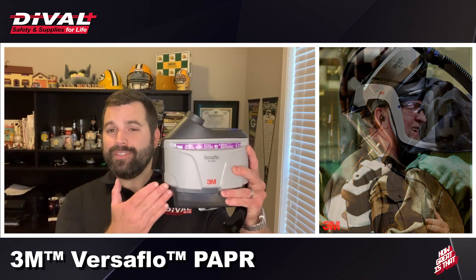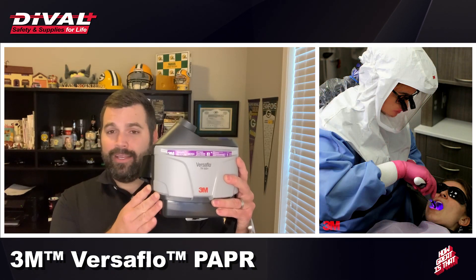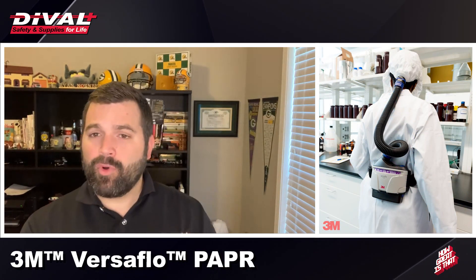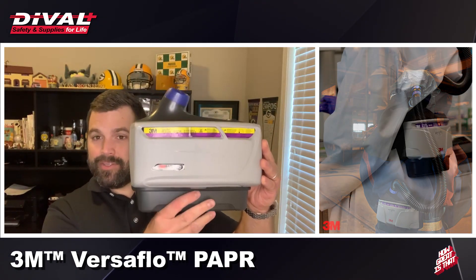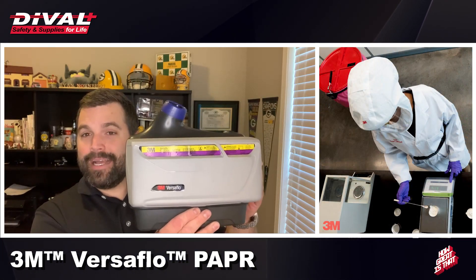The line starts with the TR-300, which utilizes a standard high-efficiency particulate filter and is your ideal solution for a majority of applications. If your application requires greater protection against vapor and acid gas, you move up to the TR-600 series, which can also take high-efficiency particulate filters but has the flexibility to add vapor and acid gas protection.